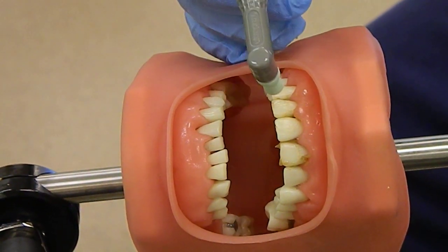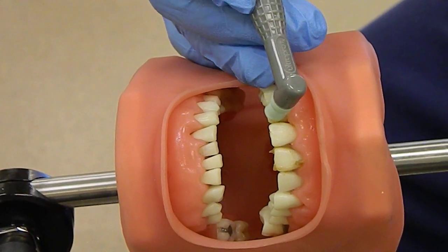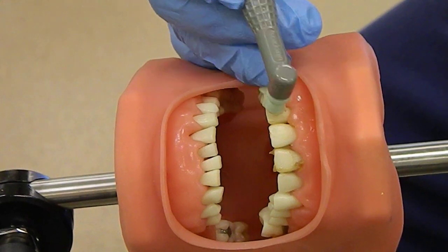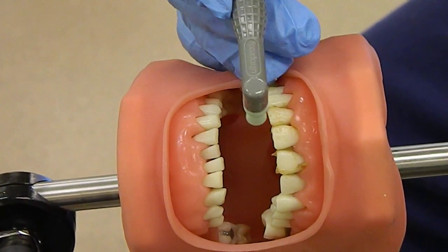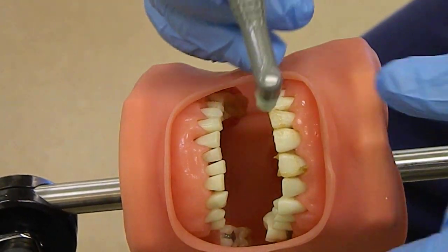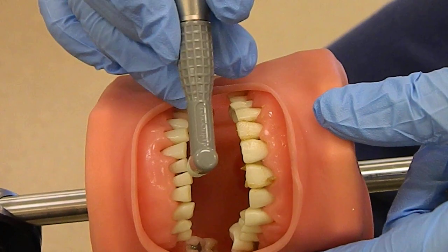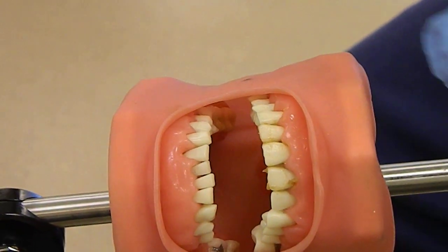You do need to put some pressure, and you're going to hear the cup stop a little bit. You really want to make sure you're flaring the cup and putting enough pressure. Otherwise, you're going to be sliding around all over the tooth, and that's not going to help. We're going to get every surface — facial, lingual, and then occlusal for the posterior teeth. And that is how you polish.